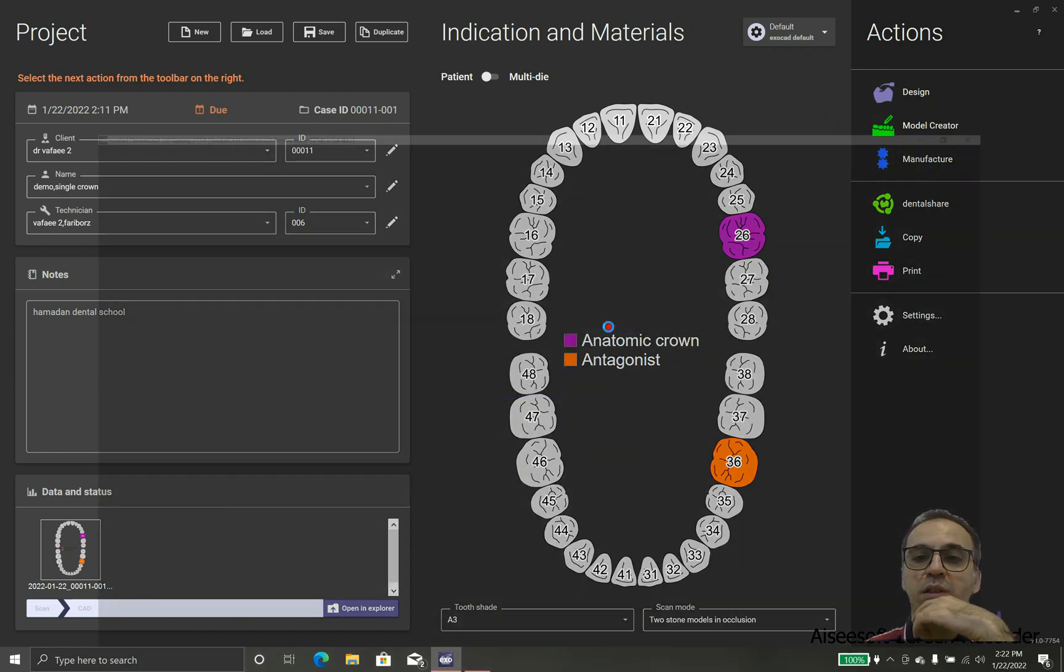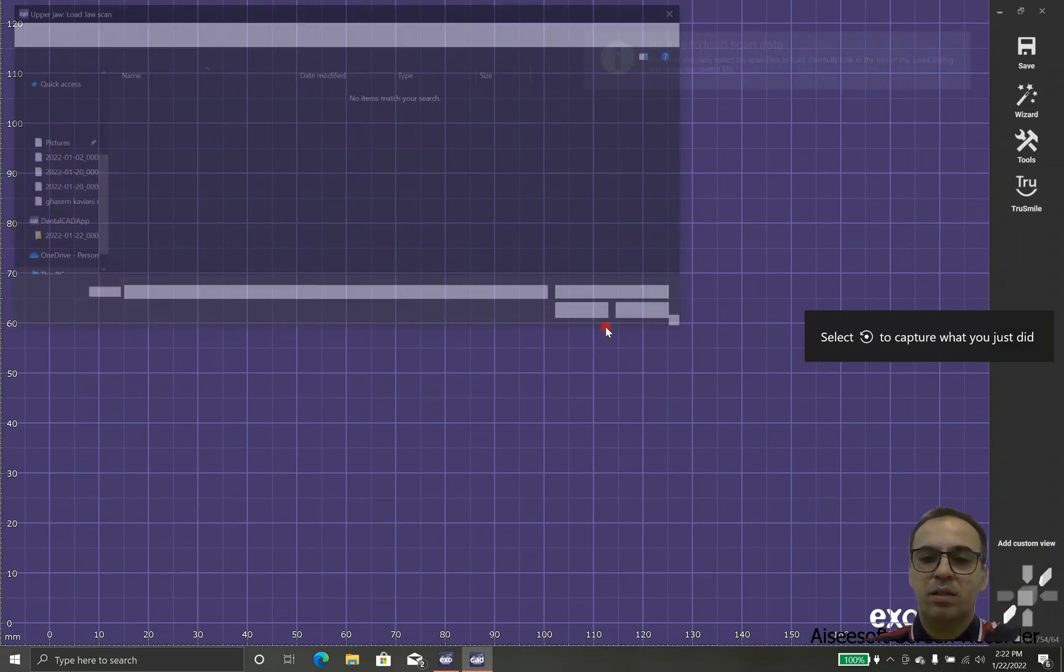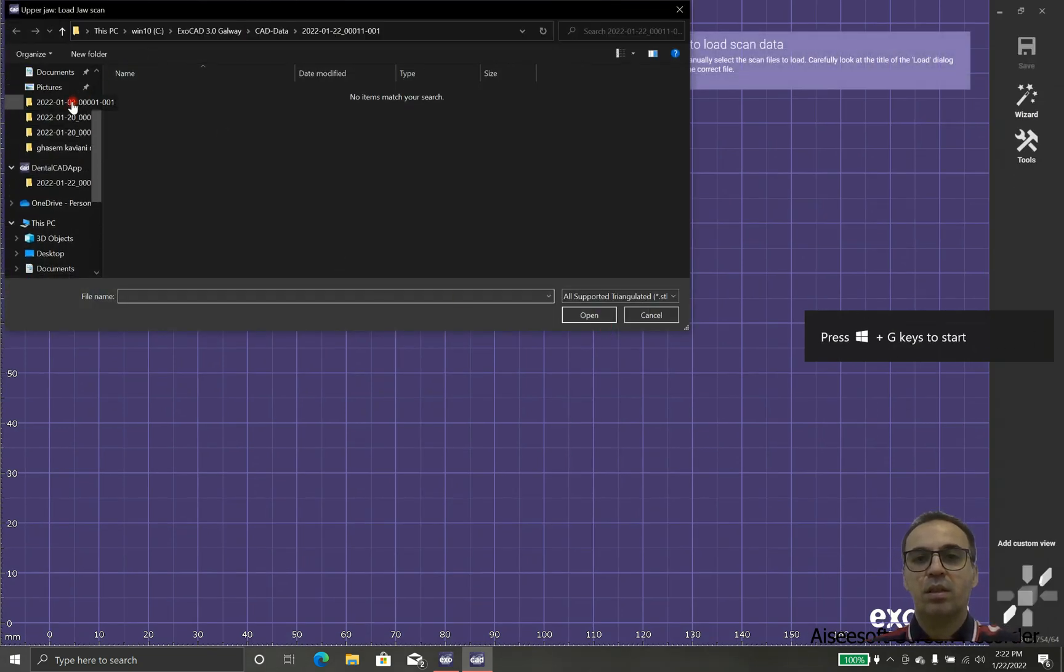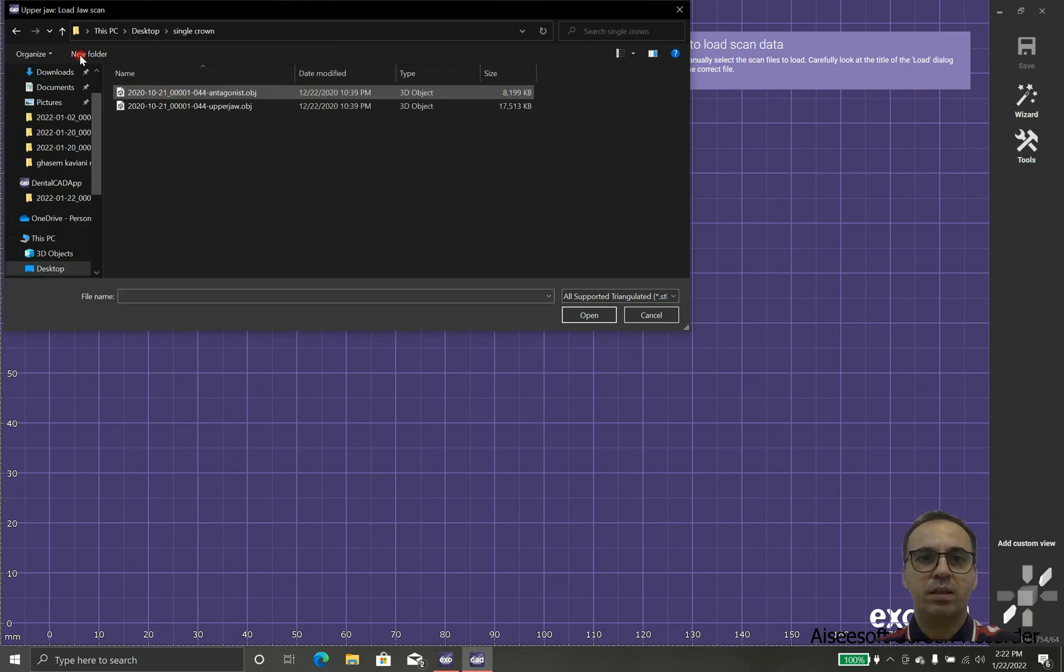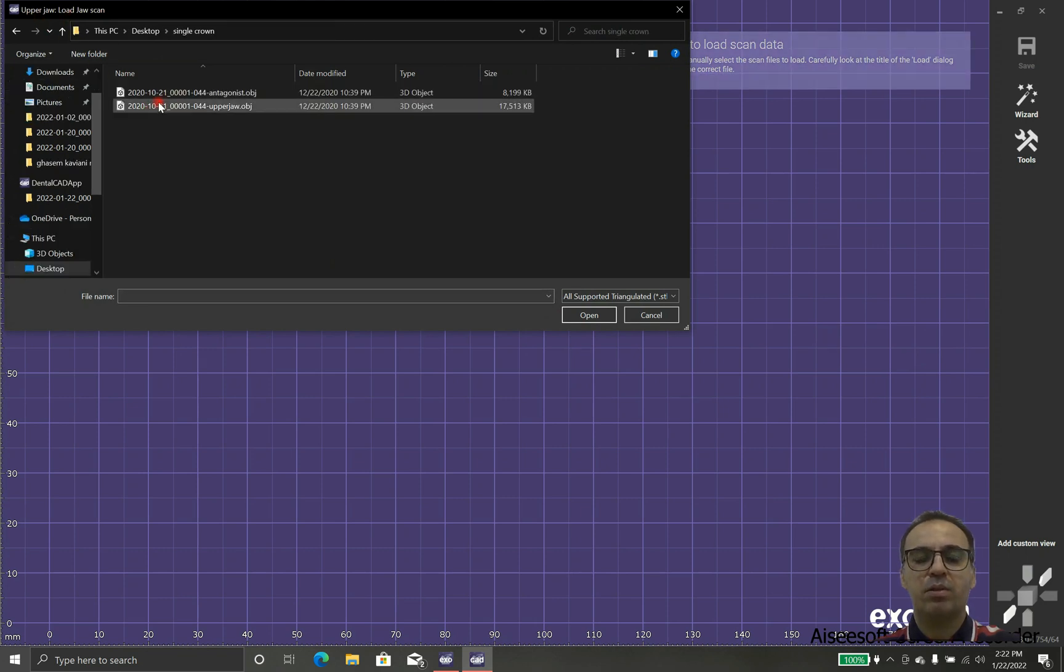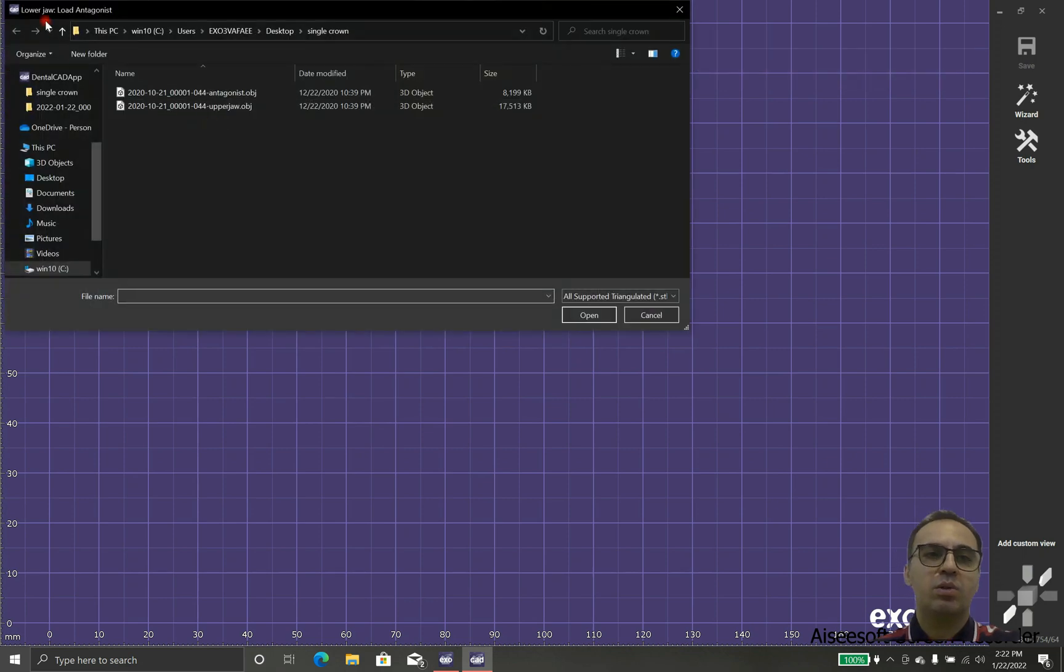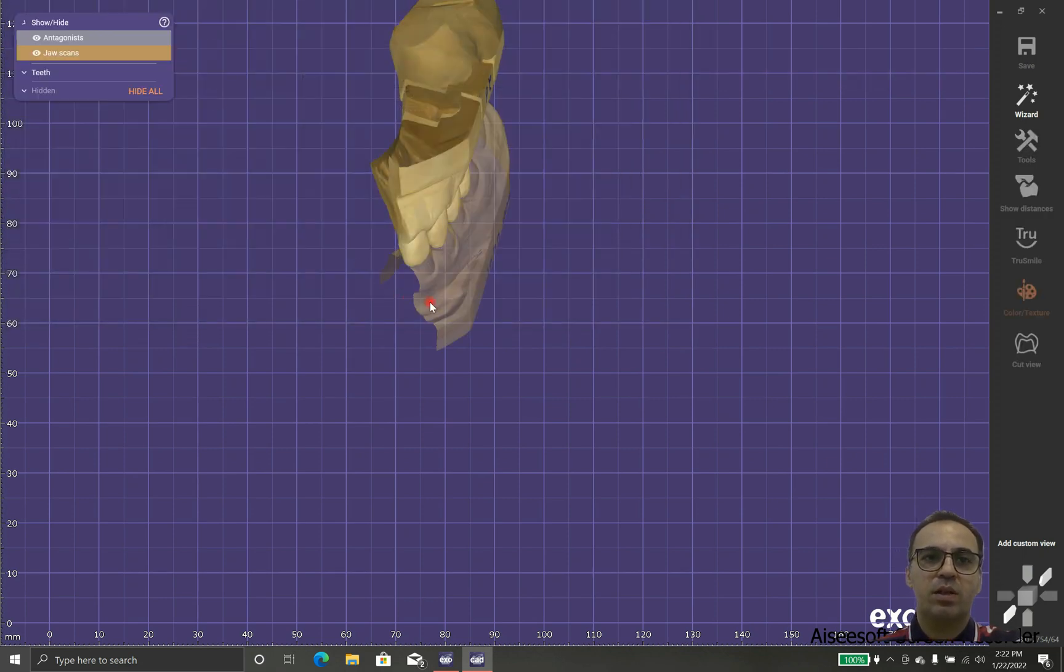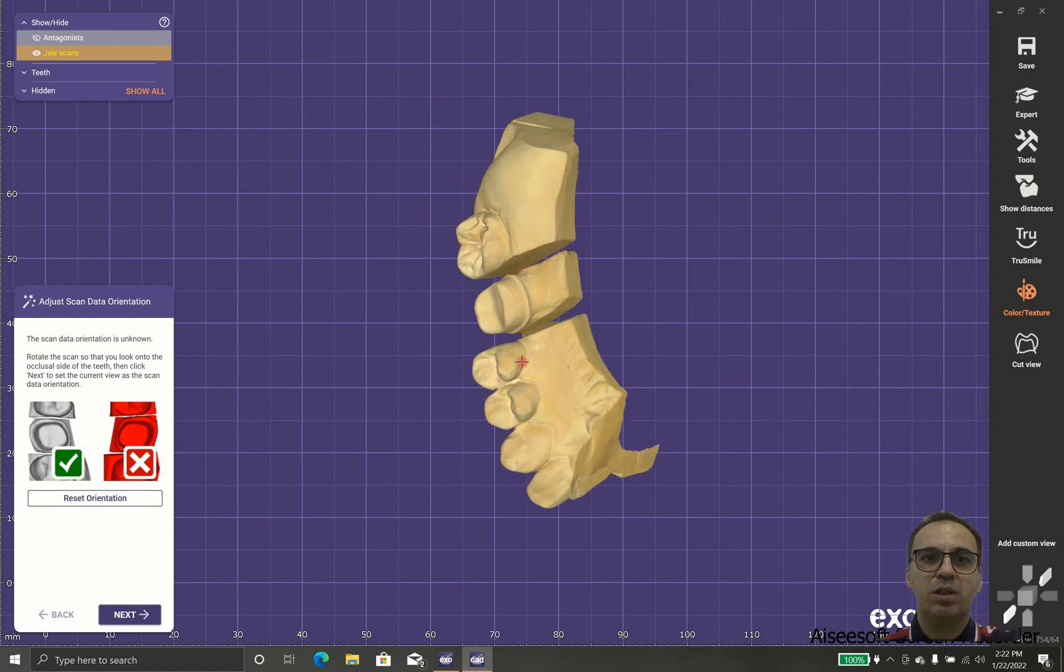And wait until program loads. We need two different scans, one for the upper jaw and one for the lower jaw.